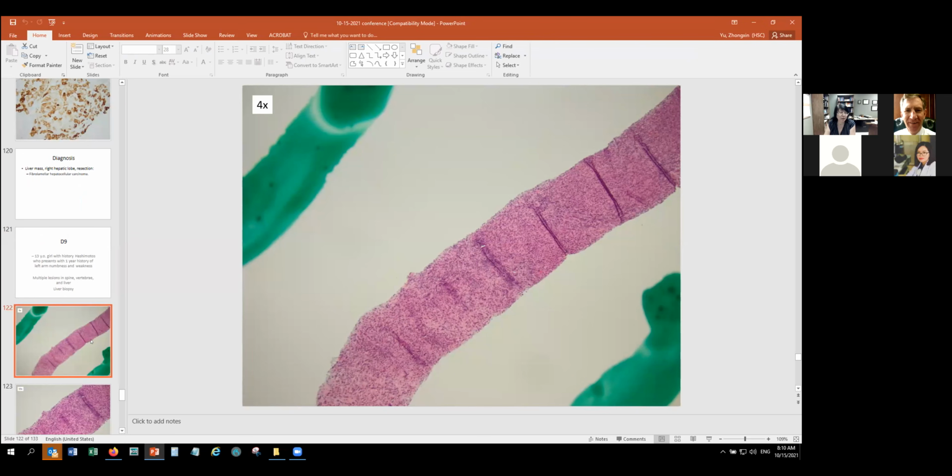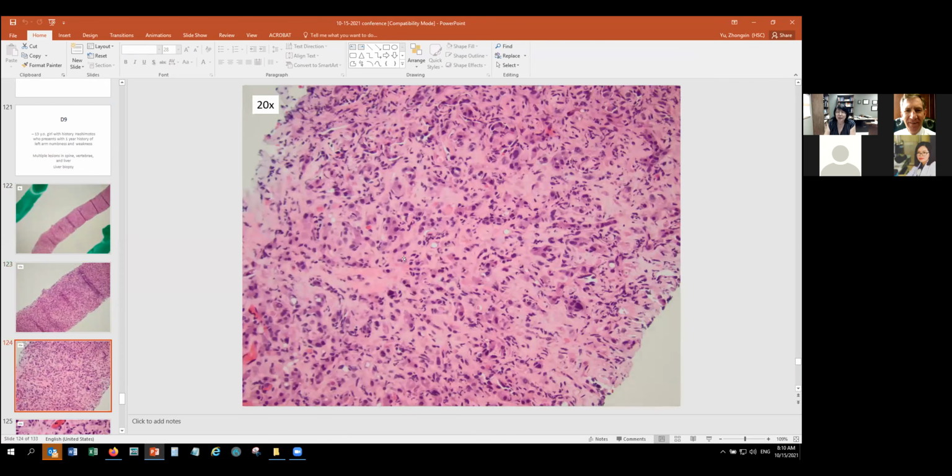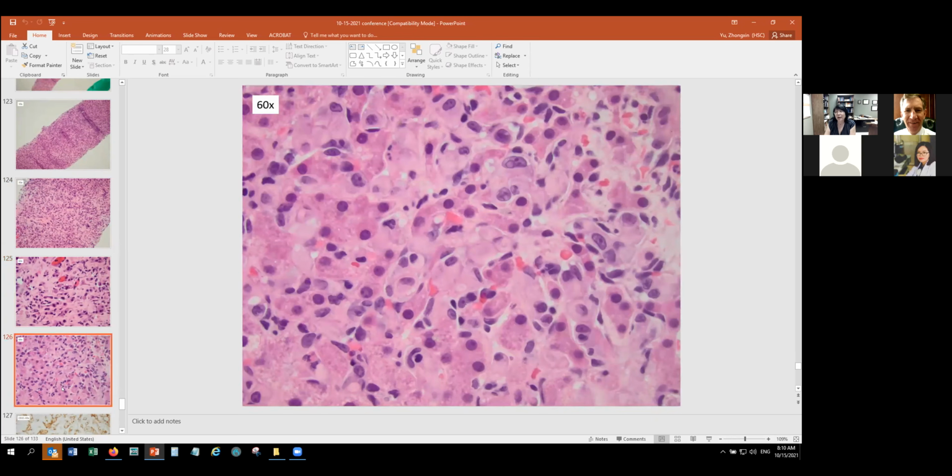So that's the abnormal area. You can see a fibrous background. Hepatocyte dropout has some pale cells like this. On close look, some try to form lumens and vessels. This one is more characteristic, I think. That's the liver core, stuffed with pale pink cells. They have an epithelioid appearance, and these are tumor cells. It looks like a sinusoid infiltrating type.